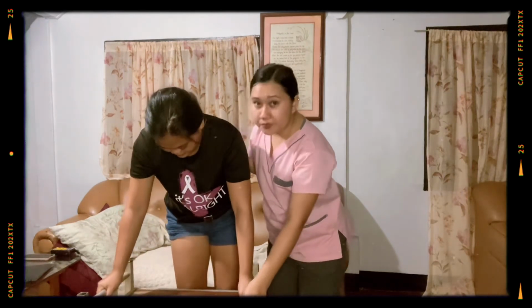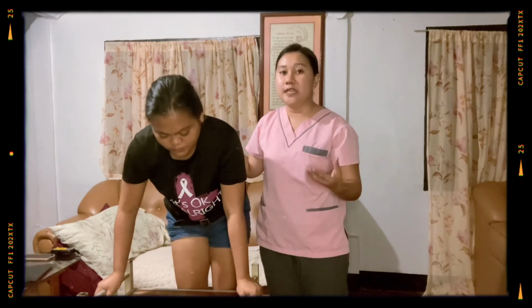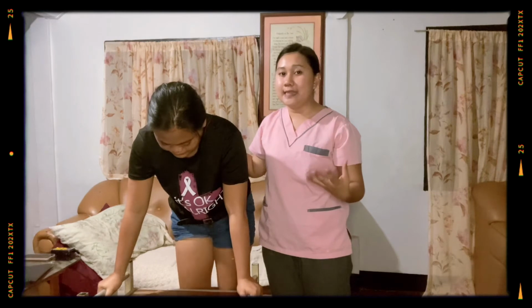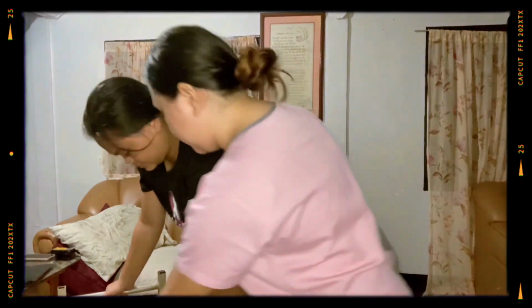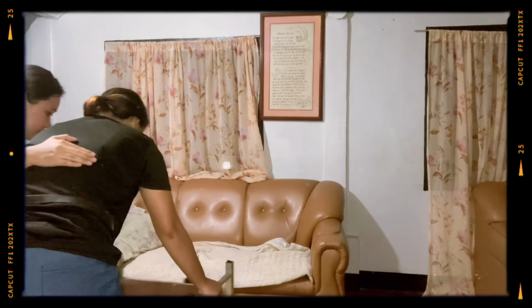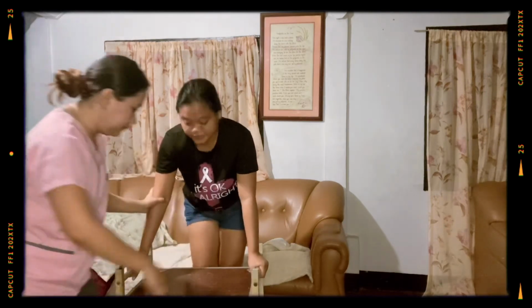Okay, good. So for the next procedure, for procedure number 11, move the walker forward again and continue the same pattern. Continue with ambulation for the planned distance and time. So, ma'am, mapalangan ta ha. 1, 2, 3, 4. Okay, ma'am.